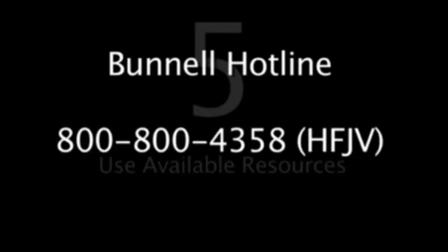Remember to call as soon as possible after determining that the alarm condition cannot be corrected. Again, most problems are very simple, and even though they may look complicated, just give us a call and we'll be able to help you. Do not hesitate to call if you have any questions or concerns. As we tell people everywhere, it is much better to call and have a good experience than not call and have a bad experience.